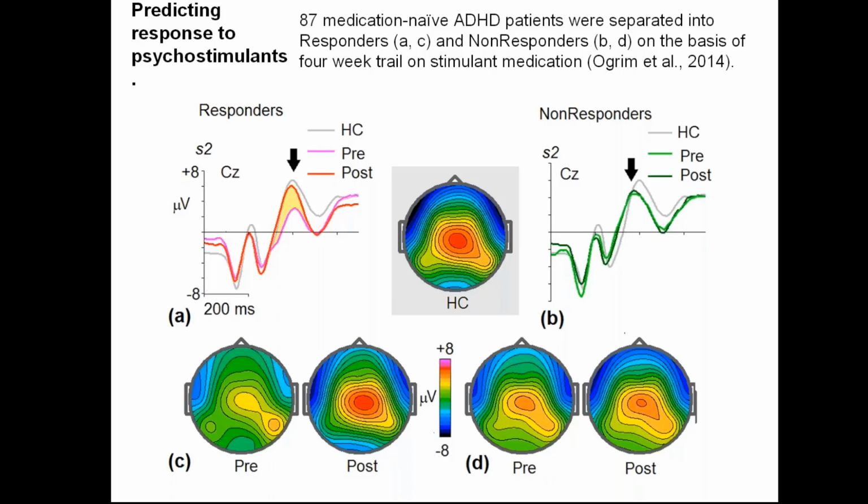Say, 1 hour after taking 1 dose of Ritalin. If you compare and you see the difference in the cognitive control component, this is a responder. If you don't see the difference, that is not a responder. The subject has not frontal, prefrontal lobe dysfunction. It has the parietal dysfunction. And this is exactly what we confirmed in our study.